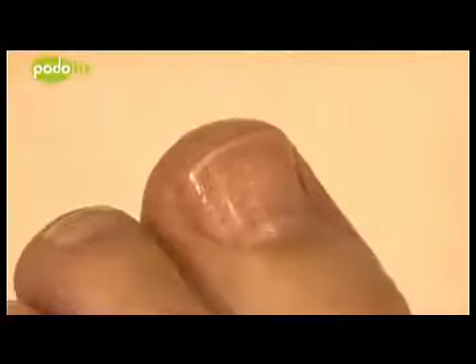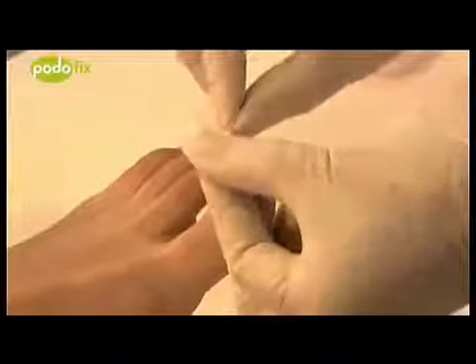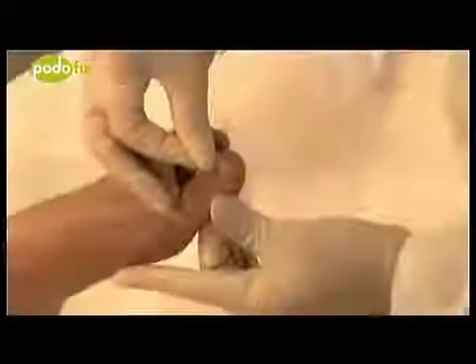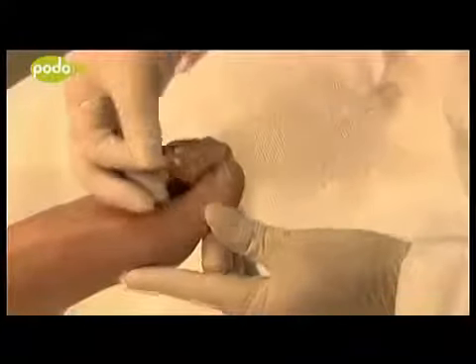Before attaching the brace, the alcohol swab is used to clean the nail. Then allow the nail to completely dry for 30 seconds. In order for the brace to lie completely on the nail surface, the fingers are used to bend it to correspond to the curvature of the nail. The brace is also cleaned with the alcohol swab and must then be dried for approximately 30 seconds.